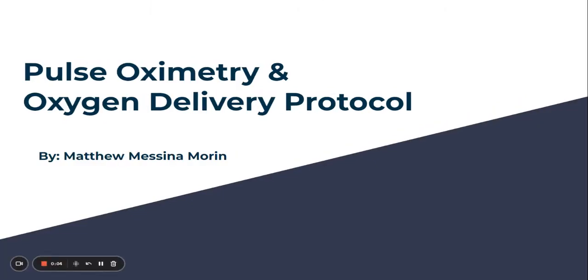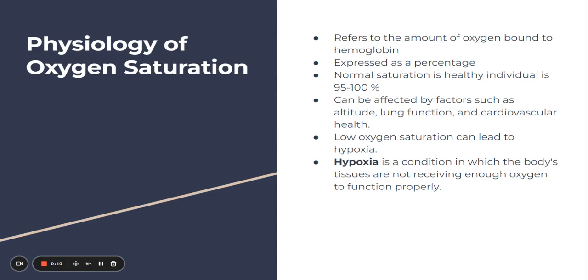Welcome to this lecture on pulse oximetry and oxygen delivery protocol, which is our Tech 10 protocol. So let's start off by just quickly recapping the physiology of oxygen saturation.